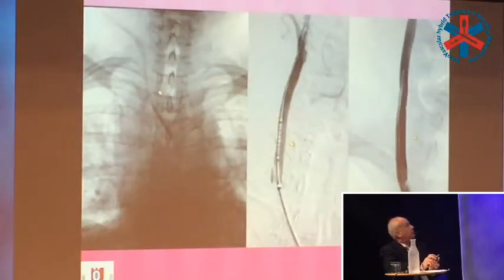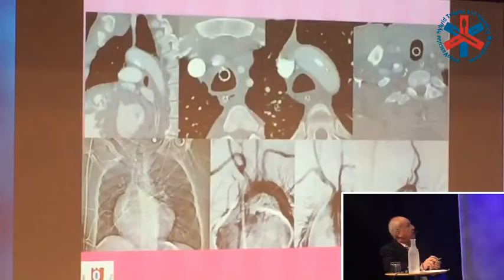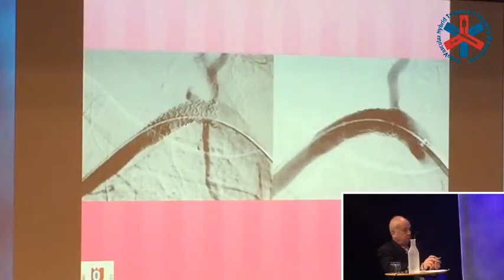This is nephrology people trying to place a dialysis catheter, and they put it into the carotid artery. So we pull the catheter out, and then we put in a stent and take care of the problem. You can see, after we remove the catheter, a hole in the carotid artery, well fixed by the stent. This is another case of nephrology putting a catheter into the internal jugular vein, but this time into the aorta. Then we put in a stent and fix this briefly in a few minutes, 5 minutes.